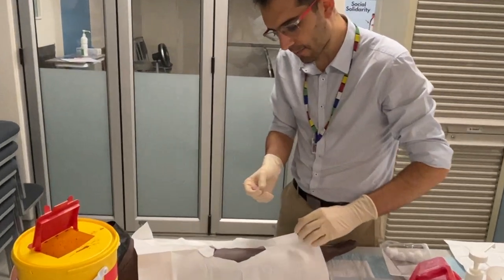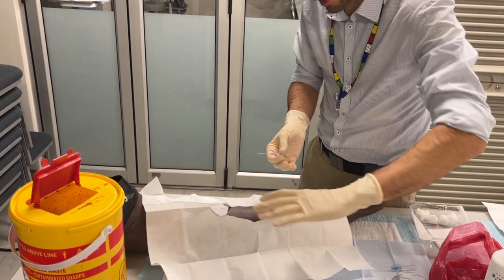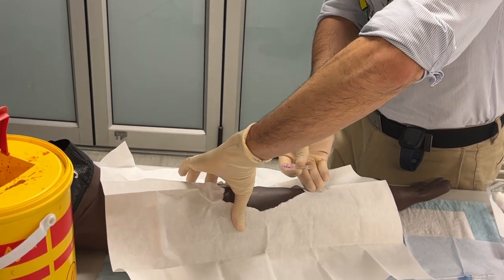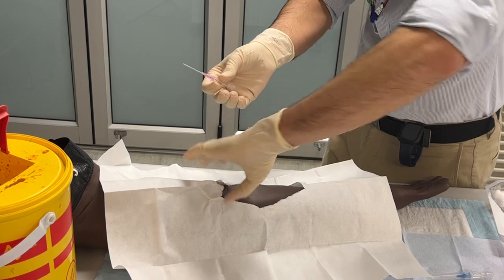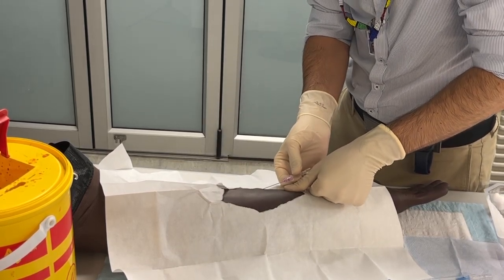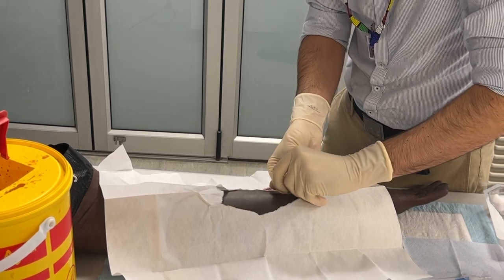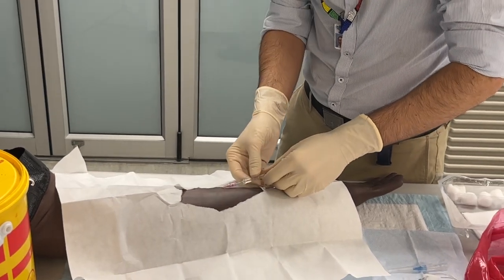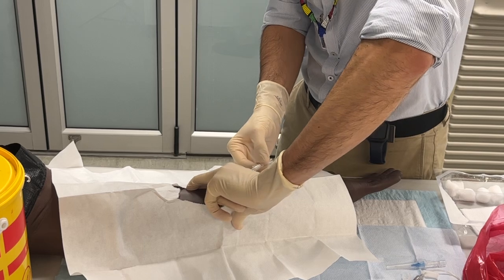Importantly, I'm not going to touch the area that I've just cleaned, and I'm not going to insert my hand at the top and then go in with the needle, because there's a risk that you're going to prick yourself if the patient moves. So what I do is I anchor the vein, insert my needle, advance the cannula through, release my tourniquet, then apply pressure and remove the needle.